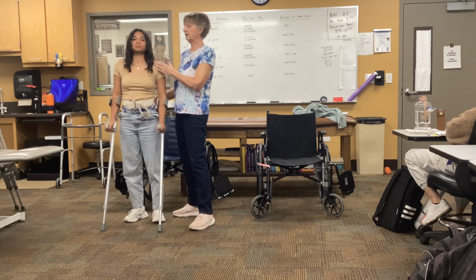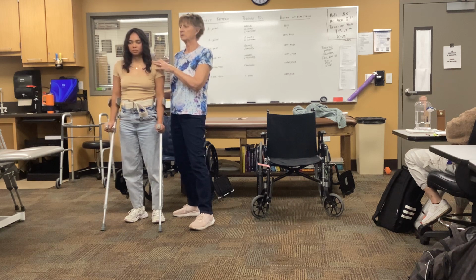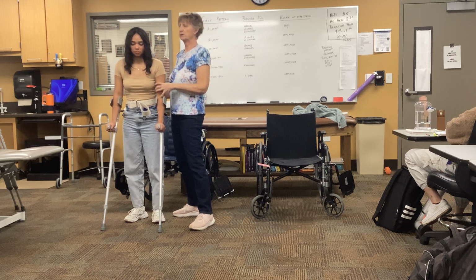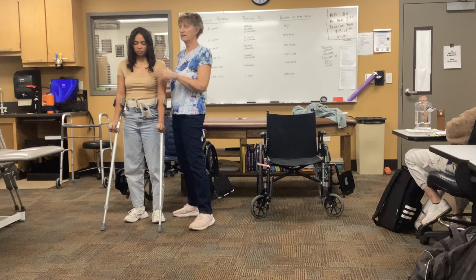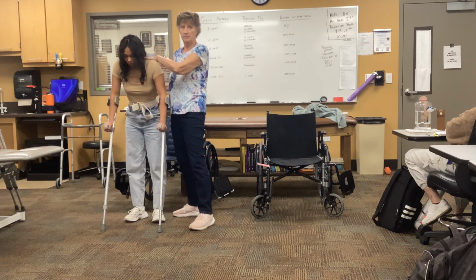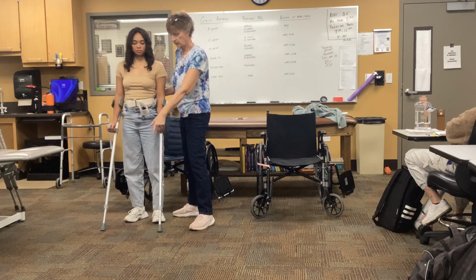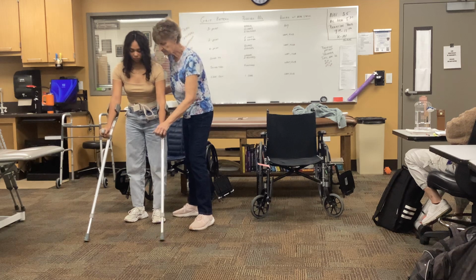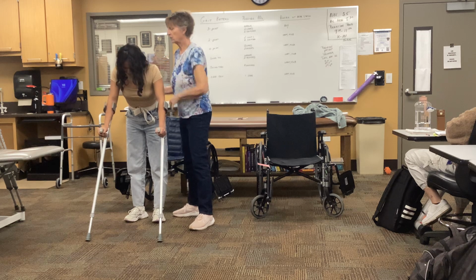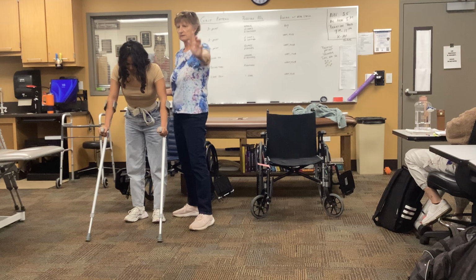Okay, so she's standing in her stable position. When she wants to move, what she quickly does is take herself out of this position. She has to have good upper trunk and arm strength, because as soon as she unlocks, she becomes unstable. So let's go back up. Quickly move those forward, keep them so you have space. She bends and quickly pushes her bottom up into the sky and swings forward.